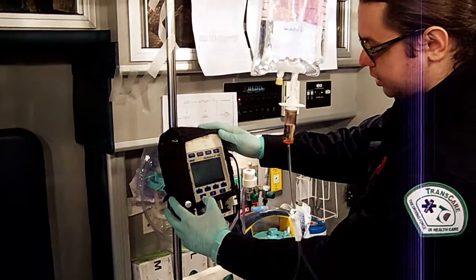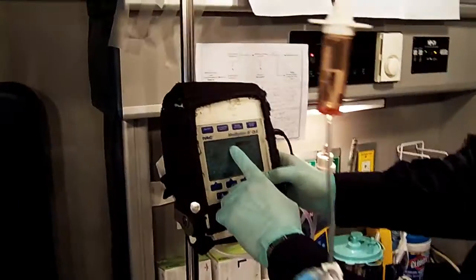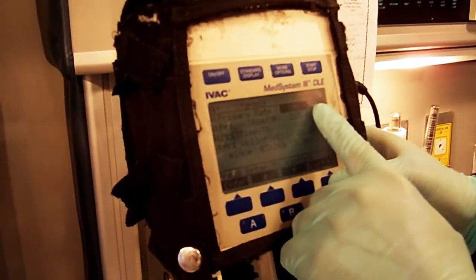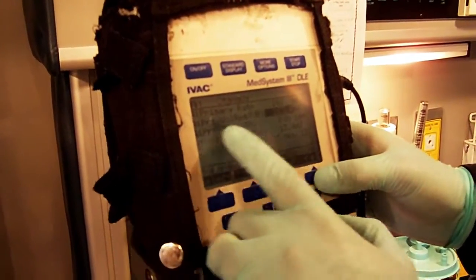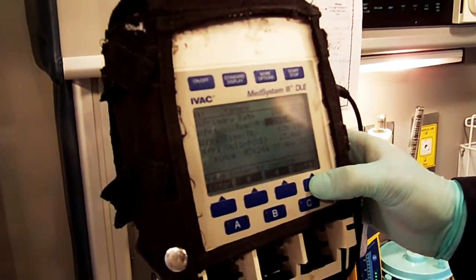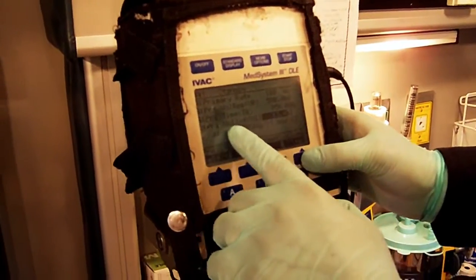These mode settings determine how many CCs of air the device will tolerate in the chamber before triggering the air sensor alarm. In this case, we'll keep it at OR2. You'll locate channel A and set the primary rate to 100 mLs an hour — enter. Volume remaining in the bag is 500 mLs — enter. We have not infused anything yet, so volume infused is zero — clear and enter.